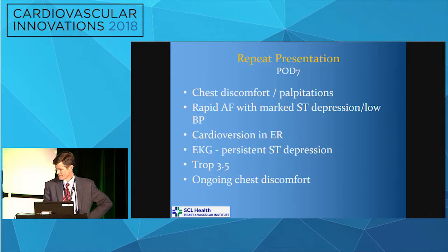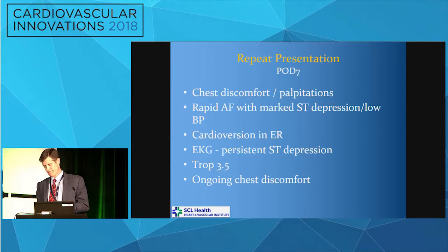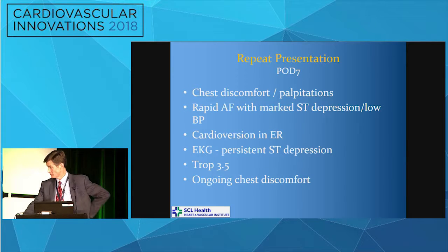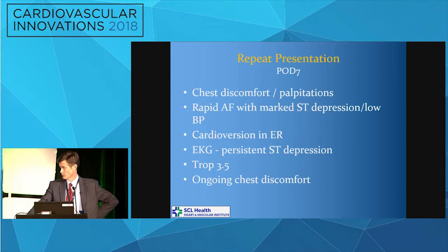Do you routinely do an aortogram at the end of the procedure? You know, we do for conscious sedation cases, Jeff, but typically not if we've got a TE probe down and our hemodynamics are okay. Sometimes it helps you if you're worried about coronary access and all that. It helps you at least know what you can tell your partners in the middle of the night.